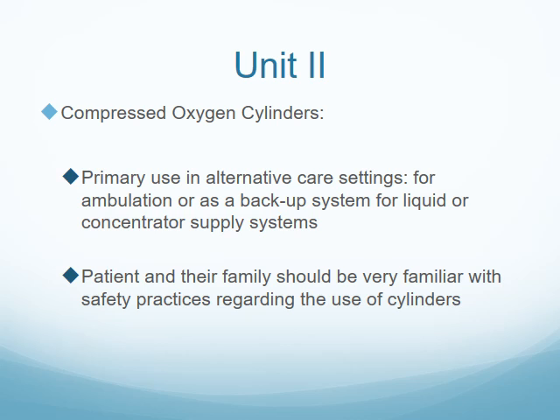In the home care setting, the home care supplier, like I said in the last lesson, will go up to the hospital and teach the patient about the oxygen, how to put the regulator on, give them a cannula, and then usually they will meet them in their home. They'll have extra supplies of tanks or the concentrator or whatever it is that they need, and then they'll also educate them again at that point.